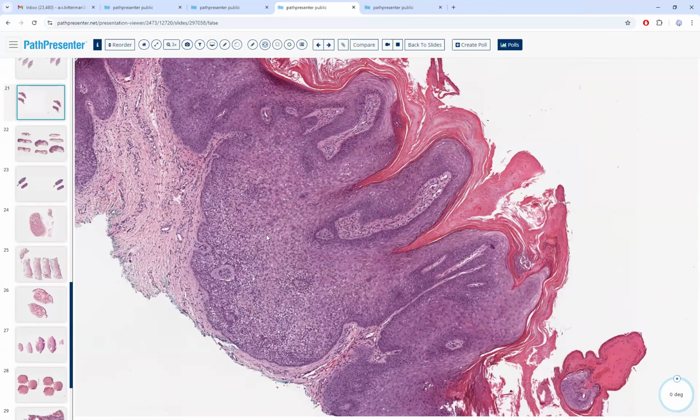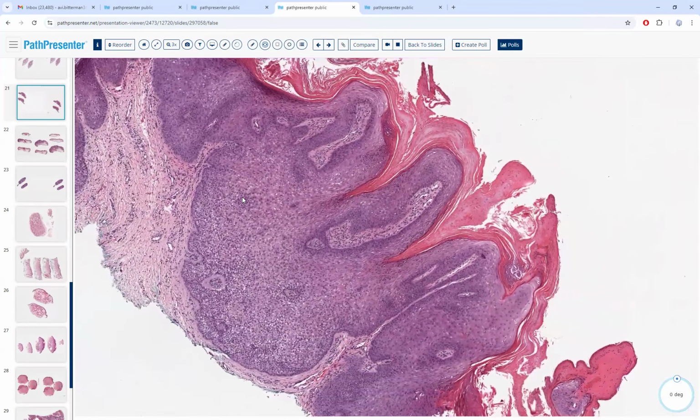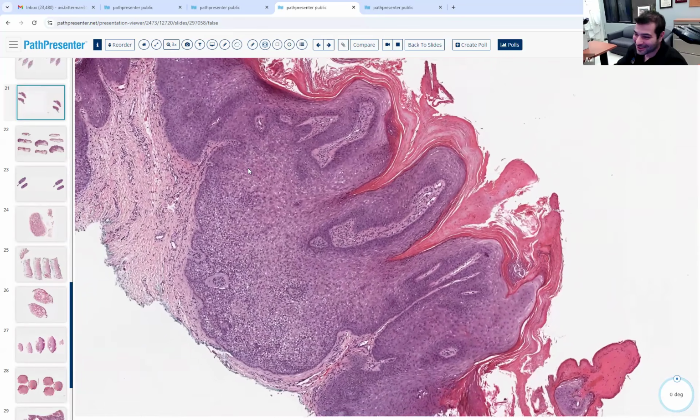The base reminds me of a trichilemmoma. Yes, it reminds you of a trichilemmoma. Do you know why it reminds you of a trichilemmoma? Because it is one. Yes, exactly. Okay, so these are warty too. So like they often get confused for warts. Yep. These are also warty.